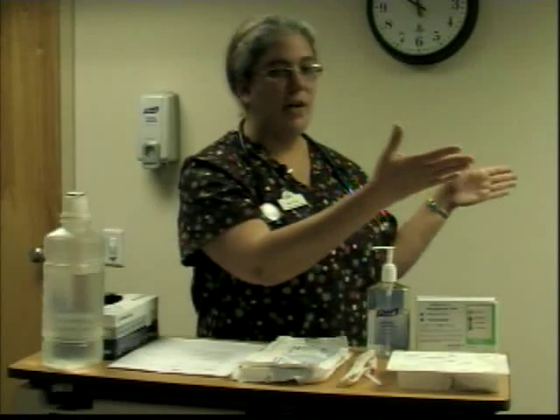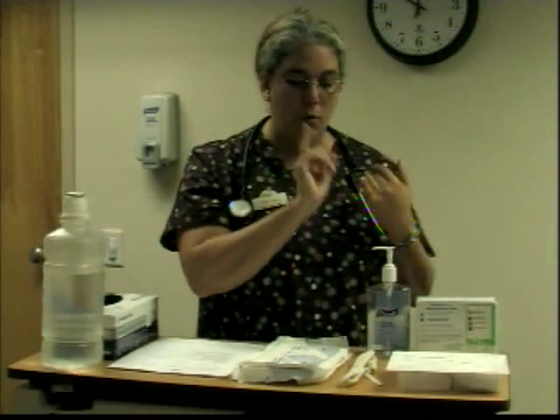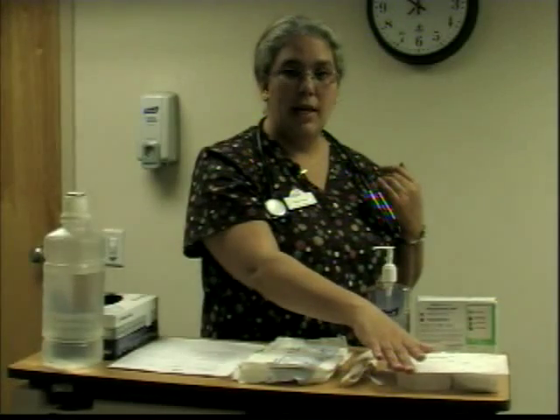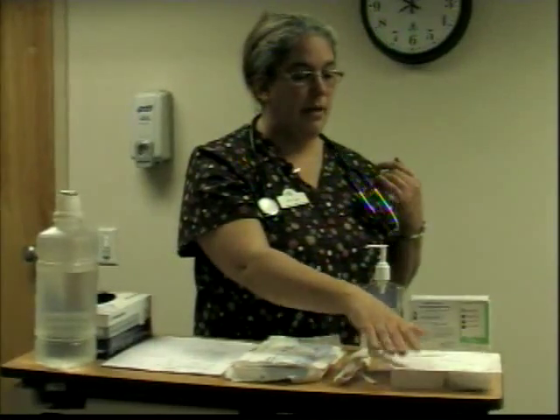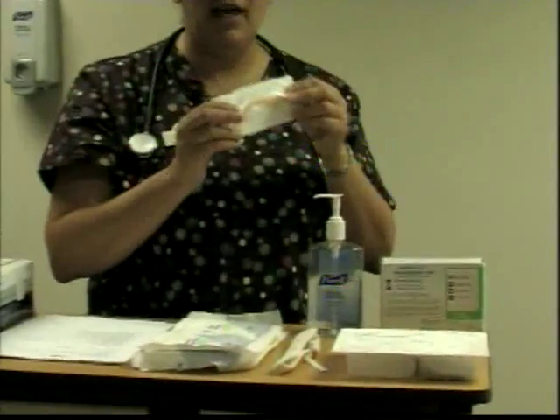You want to make sure that you have all the equipment at the bedside. So you will come into your patient's room, introduce yourself, verify your client, ask them to state their name, and then take a survey of the room. What do you need to make sure that you have in the room? One is enough suction catheters at the bedside, the trach care kits at the bedside, and plenty of inner cannulas.